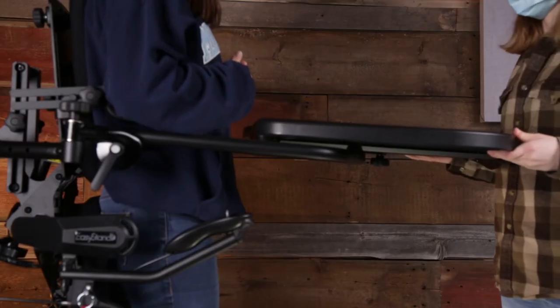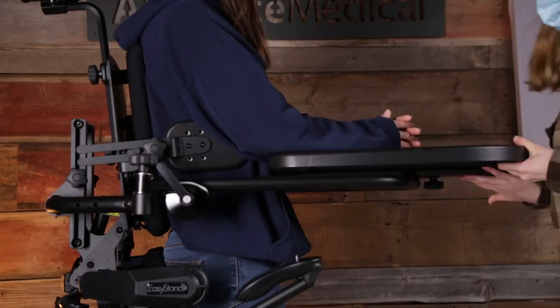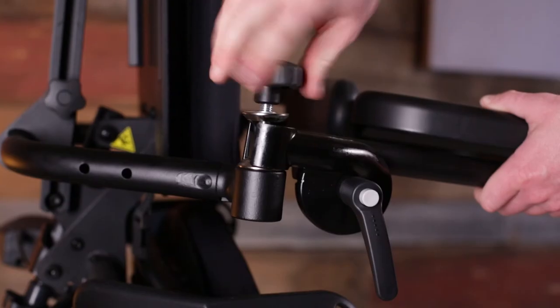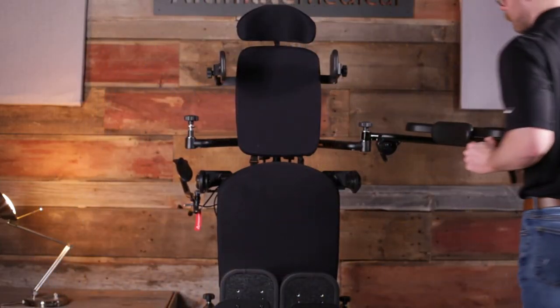With height, depth, and tray angle adjustment, it fits a wide range of users and adapts as needs change over time. This option can be ordered as a swing-away tray, where by loosening the knob on one side, the tray swings away and stays attached to the standard.